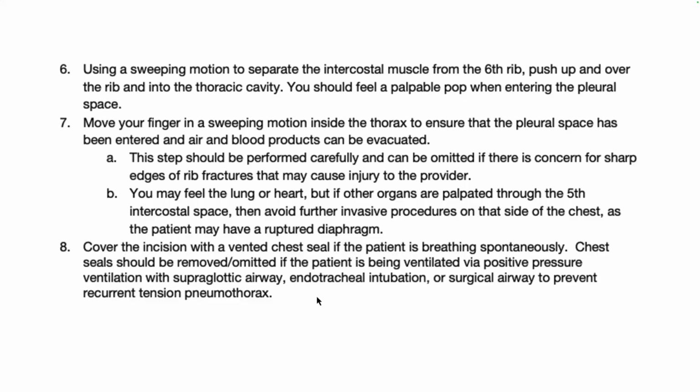And then we're going to move our finger around in a sweeping motion inside the thorax to make sure that the pleural space has been entered and any air or blood can be evacuated. Be careful, or you can even skip that sweep if you're really worried that you're going to have sharp edges or rib fractures in there.